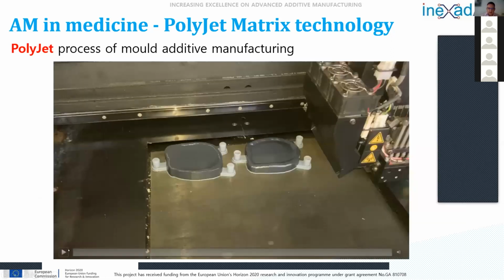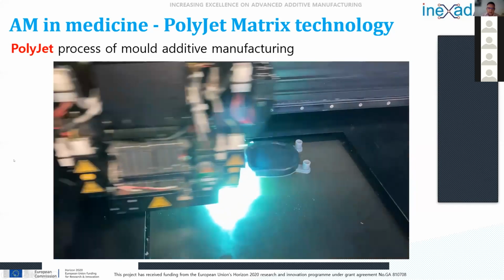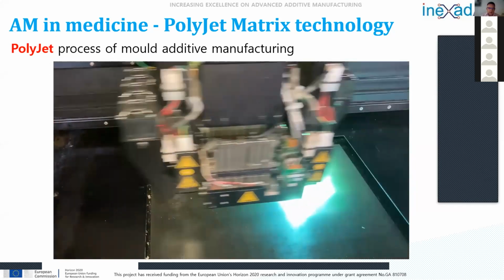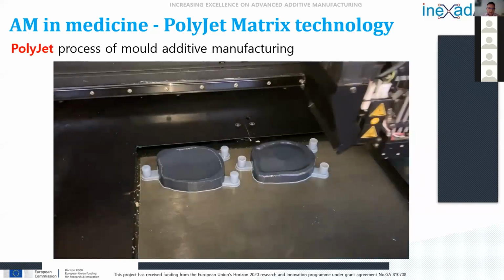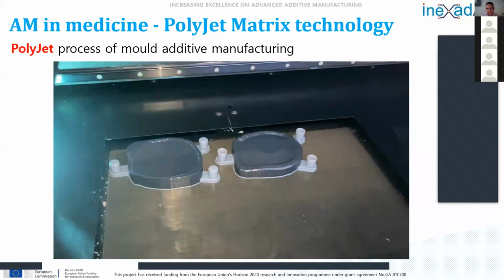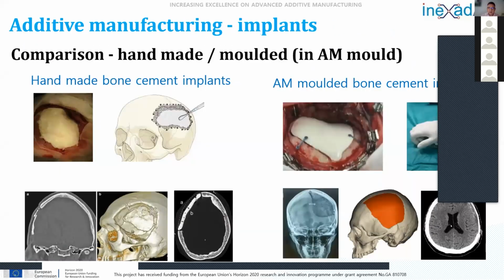You can see here our last project, a short movie about production of one of the molds for a cranioplastic implant. The mold is not finished yet, but this is a final stage of production. So in the next step, there is production of the implant in this type of mold.